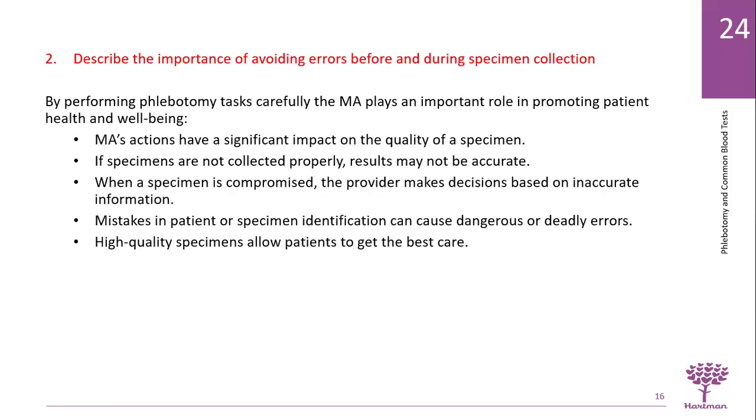Now, some of the importance of avoiding errors before and during specimen collection. By performing phlebotomy tasks carefully, the MAs or phlebotomists play an important role in promoting patient health and well-being. So, a medical assistant's actions have a significant impact on the quality of a specimen. If the specimens are not collected properly, results may not be accurate.